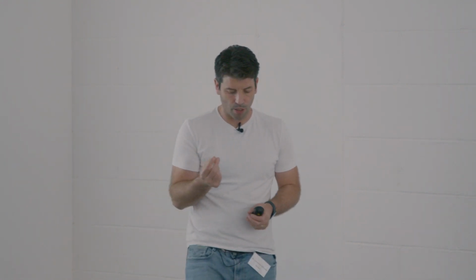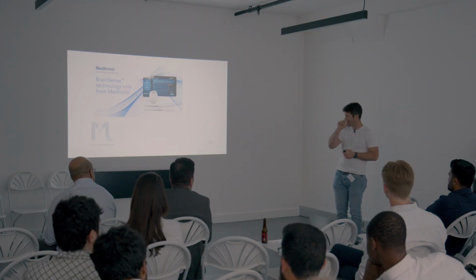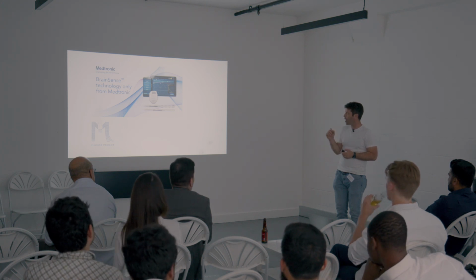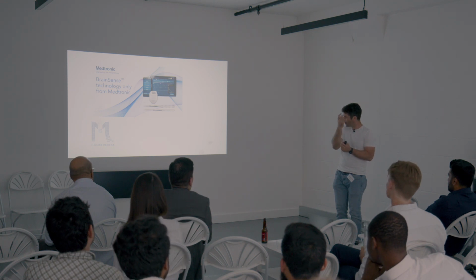Yeah. So, we're really excited about working with Medtronic, but I think arguably, one of the things that people have in their mind in the field is that somehow by measuring local field potentials, we'll be able to characterize the global neurological function of the brain. And I really don't think that's plausible, at least with systems like Medtronic's system that we have currently. But it definitely does carry some information about their clinical function.